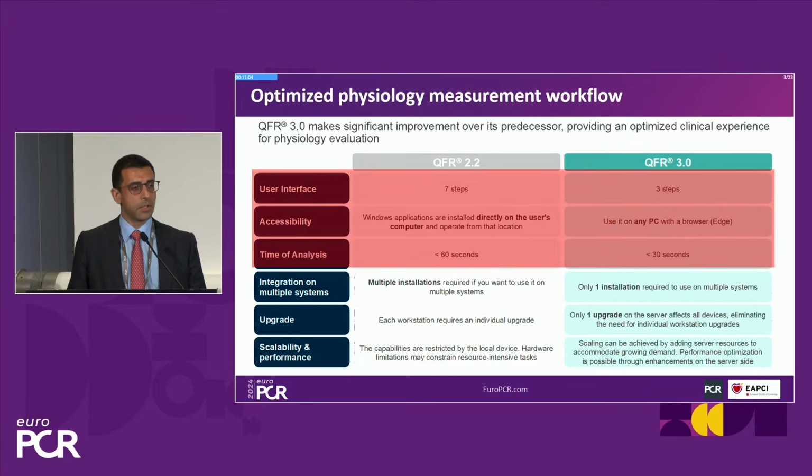Actually, the first three. We came down from 7 steps, which was the previous version. If you have some experience with that, you know that there were different steps and you had to confirm each step to go to the next one. In this new version, we have 3 steps. So if we have to stay in 30 seconds, I would say that each step takes around 10 seconds.